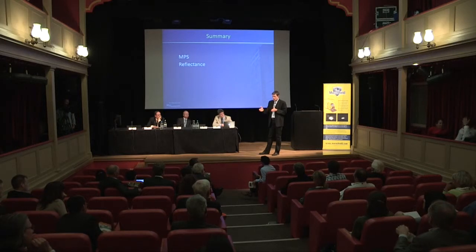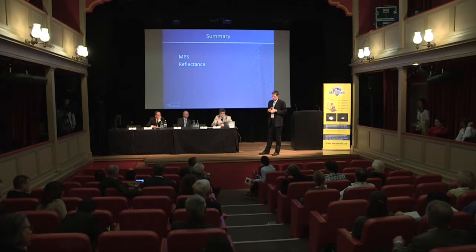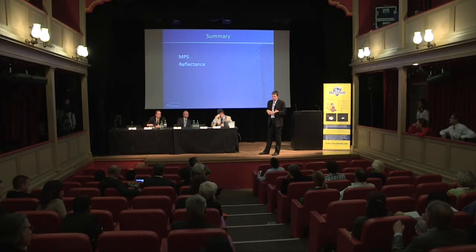I guess my answer would be, if you use it in an intervention trial, then I think you can look for changes. What you actually do by having a peripheral measurement is to compensate for differences in optical density of the lens, and I don't think within a year's time this will change that much that it will influence your actual MPOD estimate compared to the changes you want to pick up by a supplement.